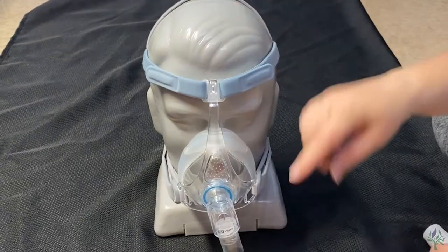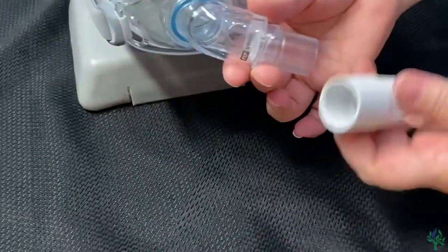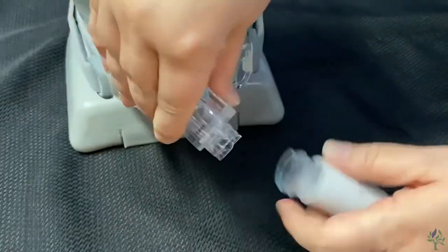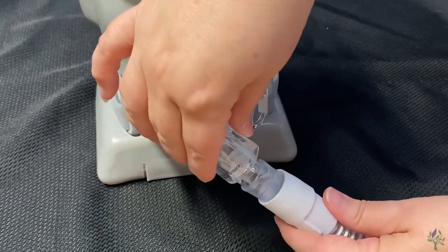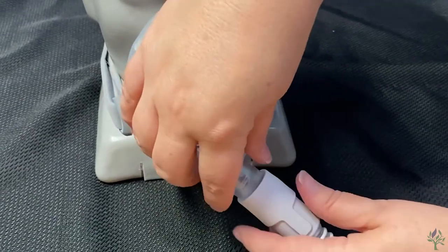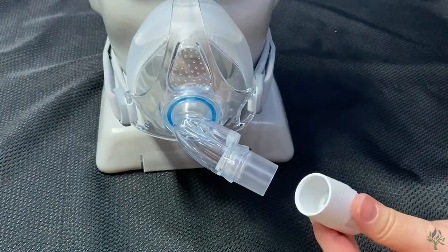One other thing I'd like to mention on this mask is this is the quick connect for this mask. As it fits into your tubing here, it will quick release there. If you want to leave the mask on to get up to the bathroom at night, when you come back, just snap it back into place. Now to remove it completely, the best way to do that is just hold the tube and wiggle it out.